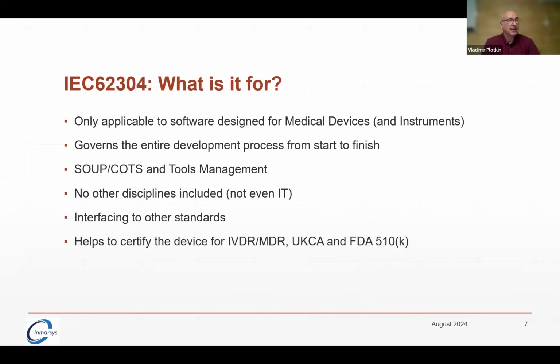So, as I said, it's only applicable for software design for medical devices, or instruments, as they're sometimes called. And you need to use this standard to define your development process from the very beginning to the very end. Another thing you need to be mindful of is how you're selecting your tools for your software development, or how you're selecting the SOUP or COTS.